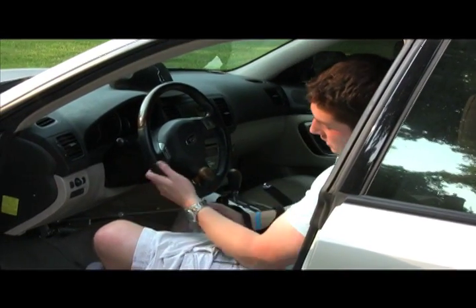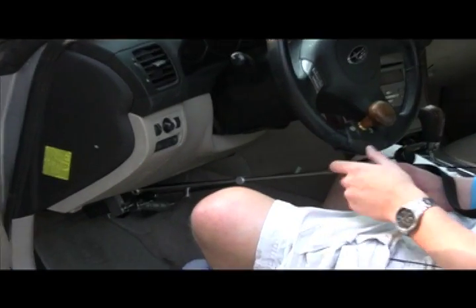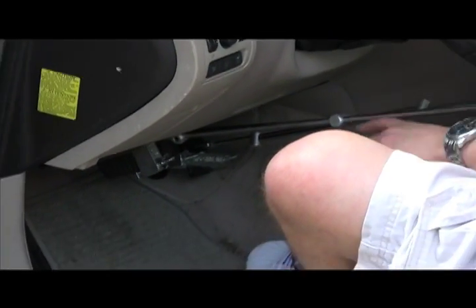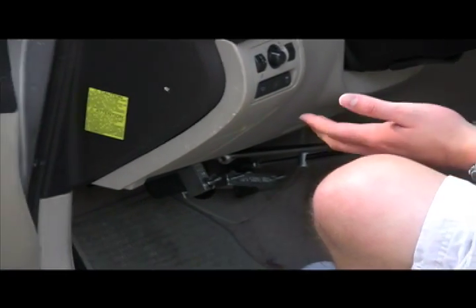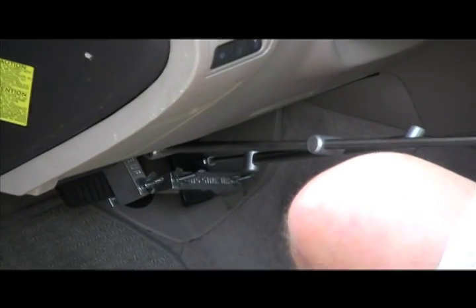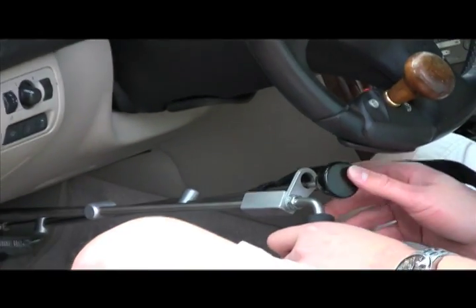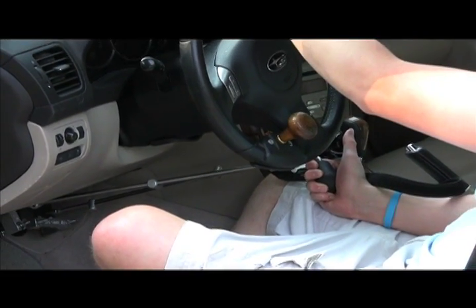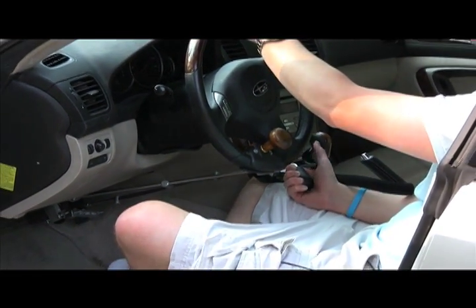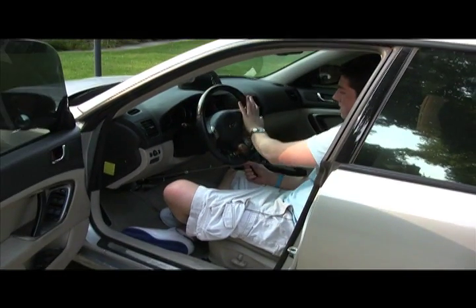As you can see, it's just connected to the pedals with a simple vice grip and butterfly bolts to tighten the vice grips down. And it's just the opposite to take it off. You just loosen those and slide it right off. It's a real simple thing to do. You push in this big lever for brake and this little one for gas. So basically when I'm driving, I hold it in my right hand like so, push with my thumb for gas, push with my whole hand for brake, and just drive with my left hand like this.